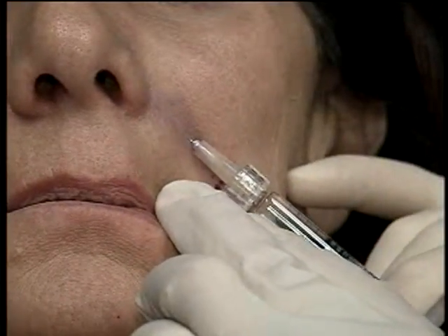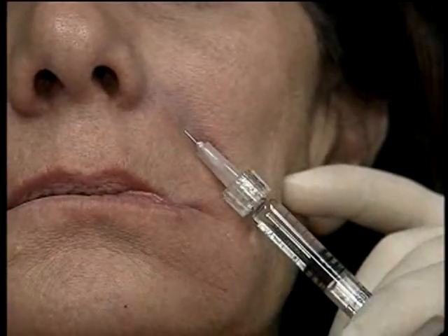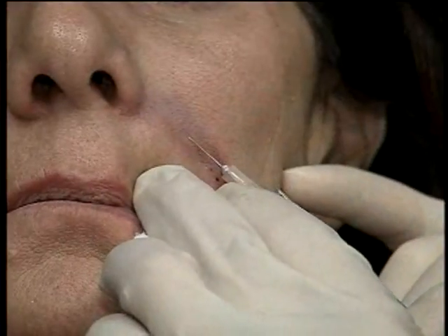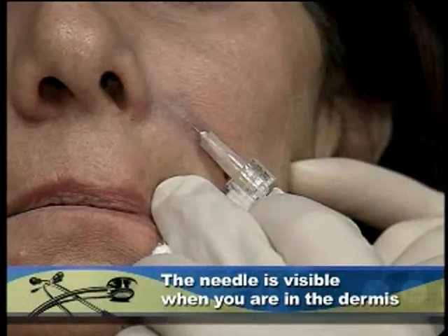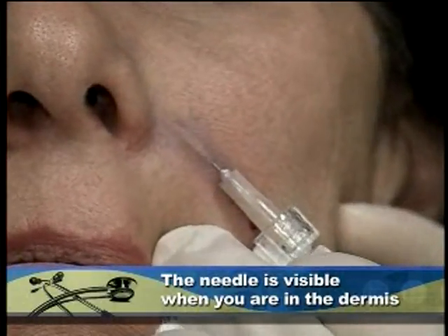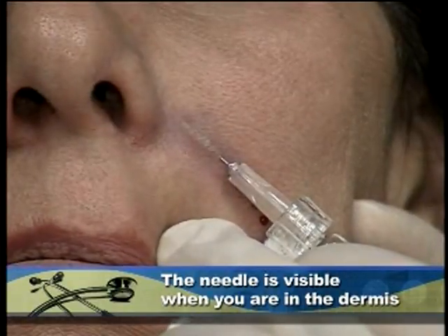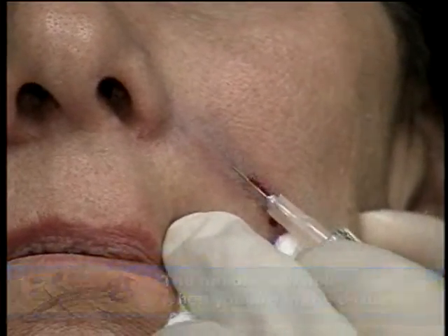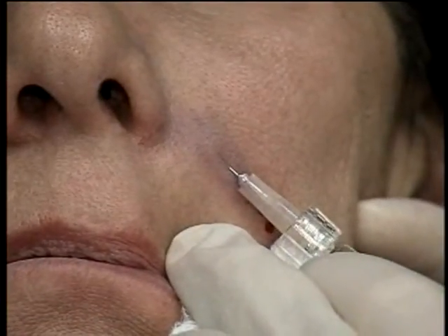Now you can see I'm actually below the dermis, and the way you can tell this is by the position of the needle. I'll show you the different areas you can be in. If you're in the dermis, like this, you can actually see the needle through the skin. That's superficial dermis. If you deposit the product at this level, you will have a blue line that will show up there, and it'll look like a little worm under the skin. It won't look good.